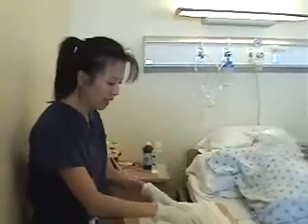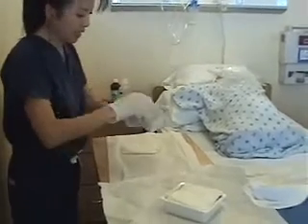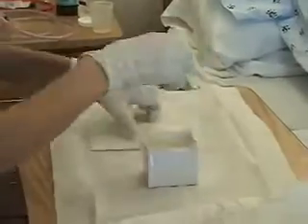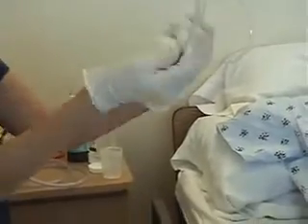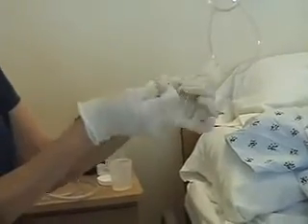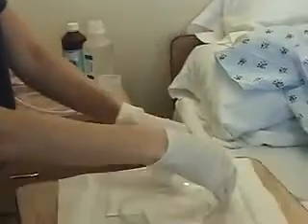Sterile, sterile. Now you can manipulate all this very easily. You want to have a little container where you can put saline solution in it. You want to take the suction tube out of the bag and stretch it a little bit, so this way the suction tube is not that stiff, it's more flexible. Okay, so you get all this ready.